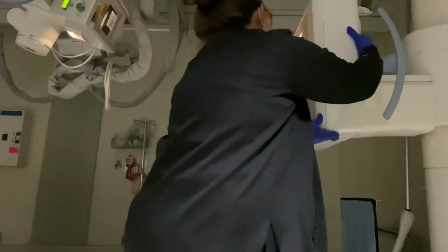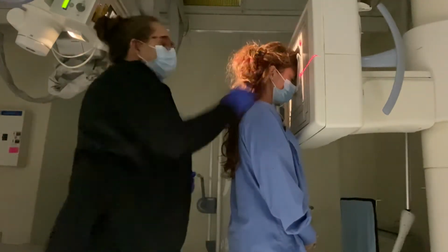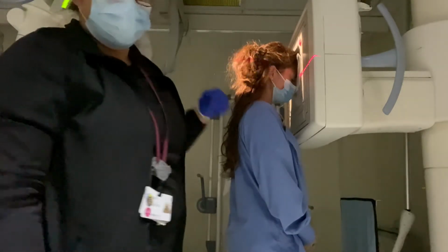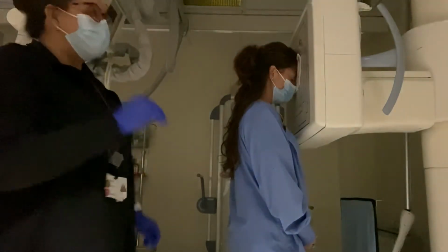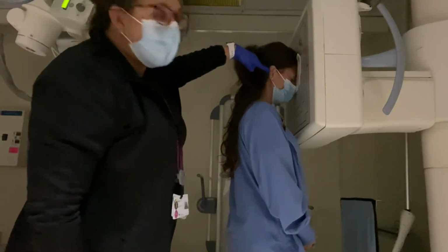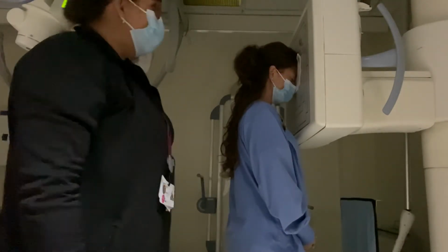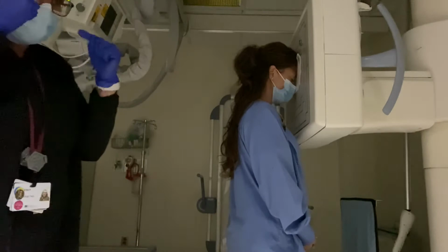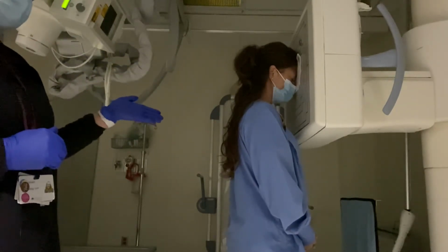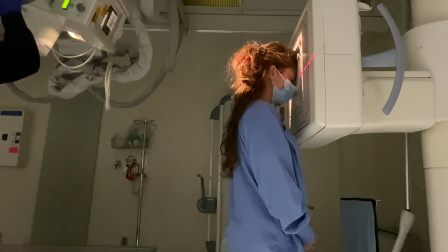I'm going to raise my tube up, my bucky up just a little bit. And then I'm going to put my right marker on the right hand side. Now, when we're doing the PA Caldwell, you want to make sure that the patient's orbital meatal line is perpendicular to the IR. So from the outer canthus to the EAM, that imaginary line should be perpendicular to the IR. That's going to make sure that your petrous ridges are in the lower 1/3 of the orbits. So you'd have your patient stay just like that, and then you would take that image for the PA Caldwell.